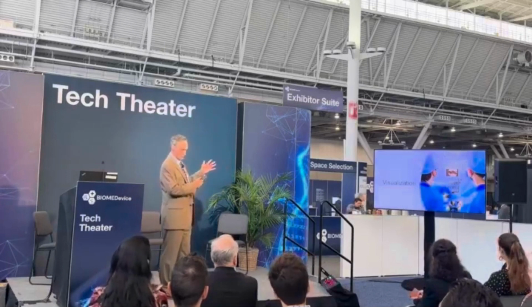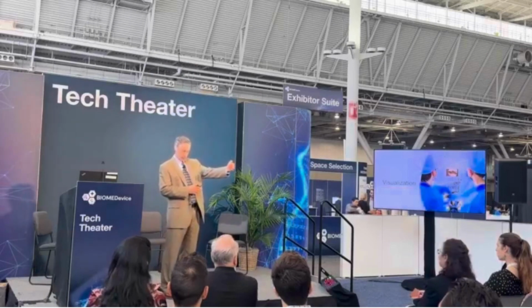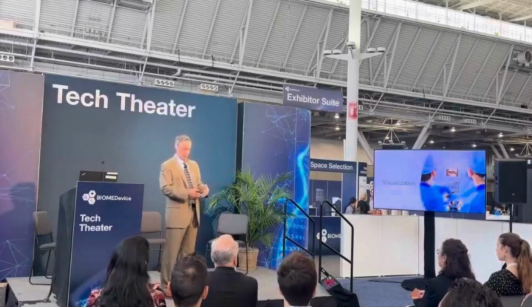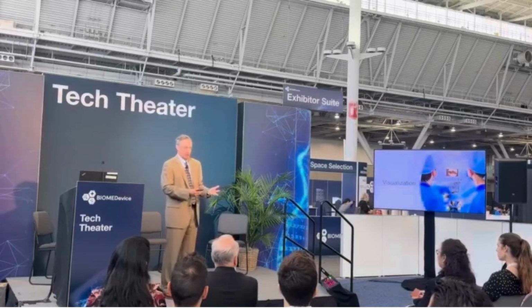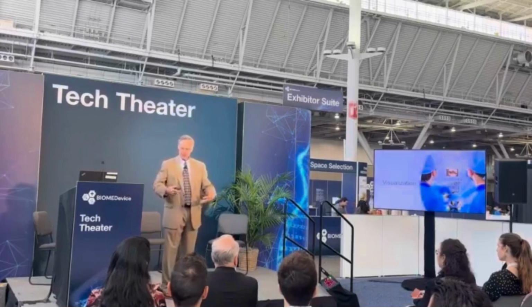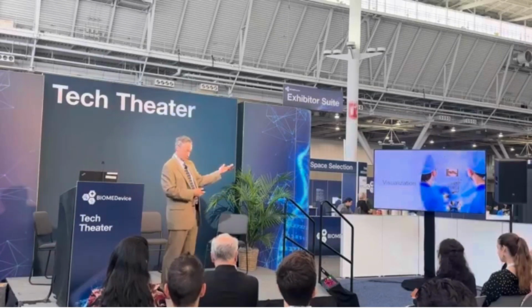Now, it might have been just for effect, but I've seen this happen where the surgeon is actually squinting to see the image of what they're working on, and the camera company is cringing and saying, why do you set up this way? You put so much effort into this. So the setup affects a lot of things, including visualization.